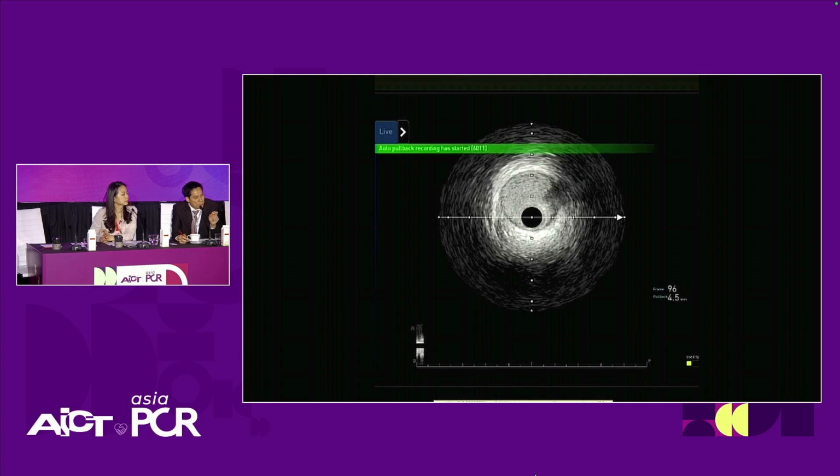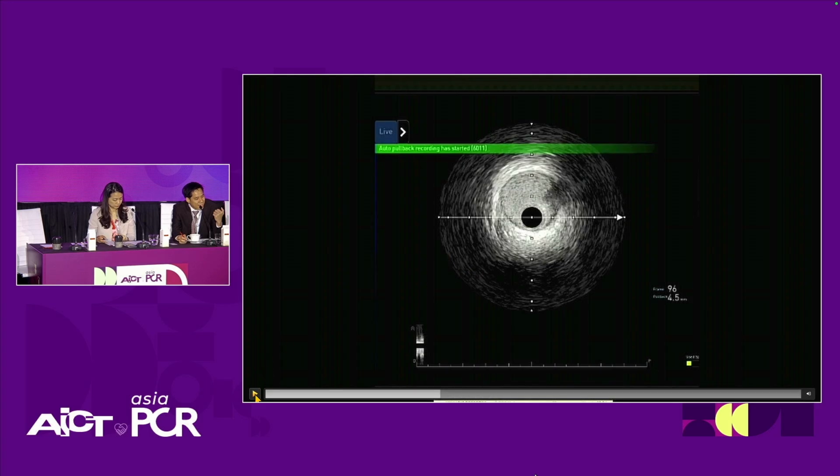It is just a focal area, so I might use 2.0, but I will focus on the tightest one, not go all the way through. That is my approach. Orbital you can do, but I still like rota because it is faster.